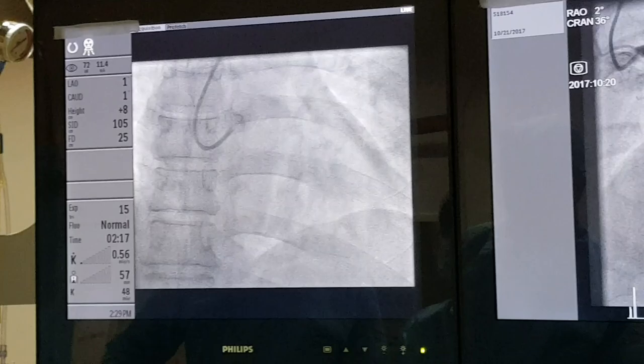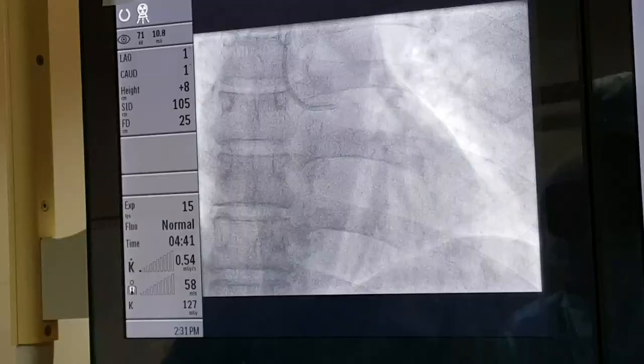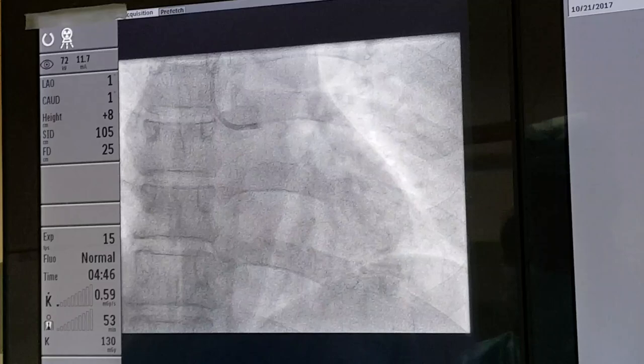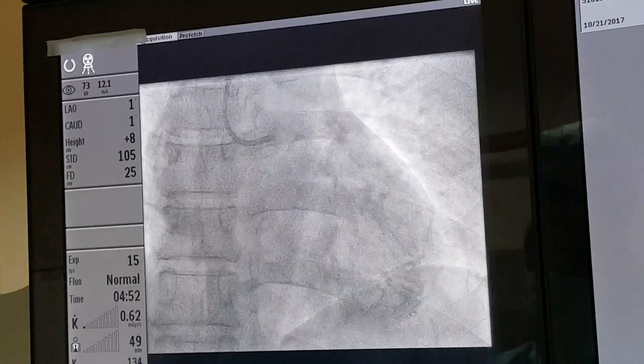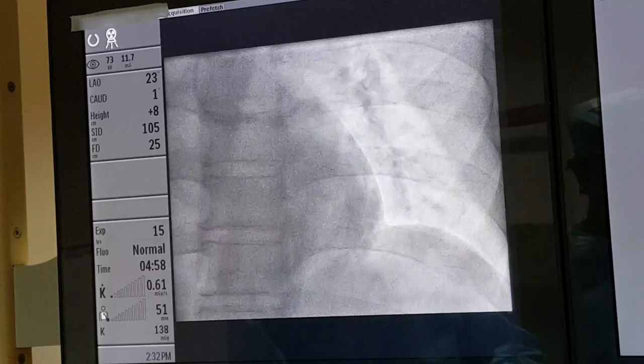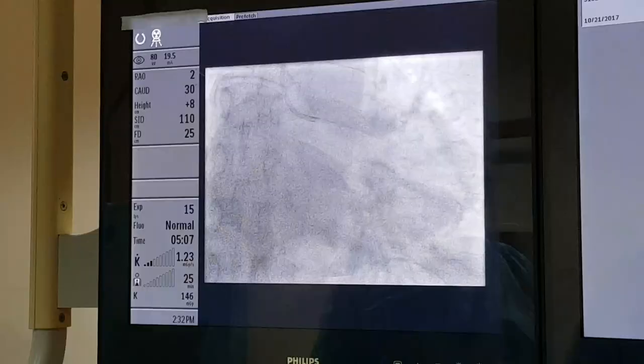Now I have maneuvered the guiding catheter to engage the coronary artery. That is the left system — the left main dividing into the circumflex and LAD. Now I am performing an angiogram to identify the block.